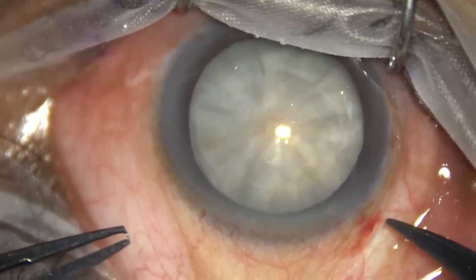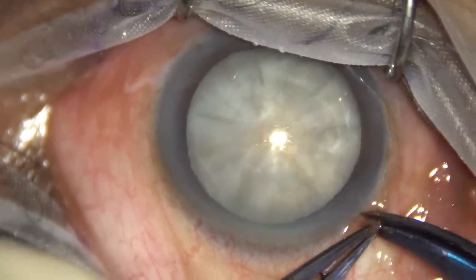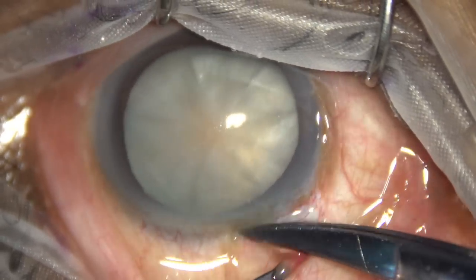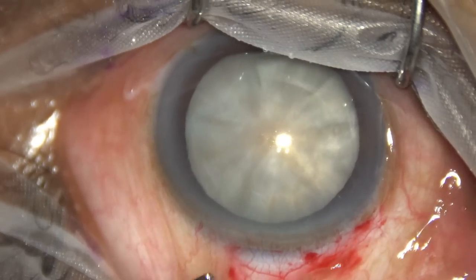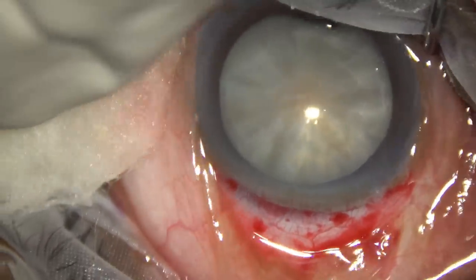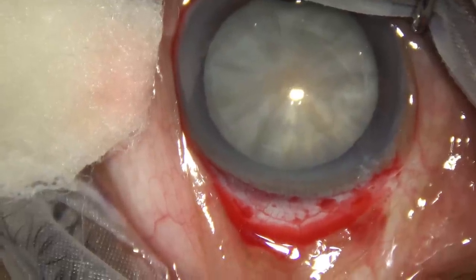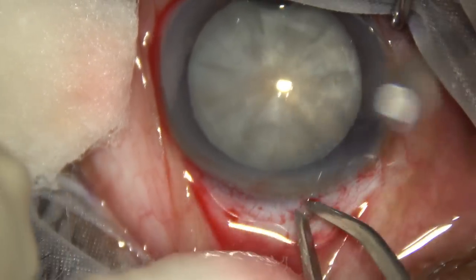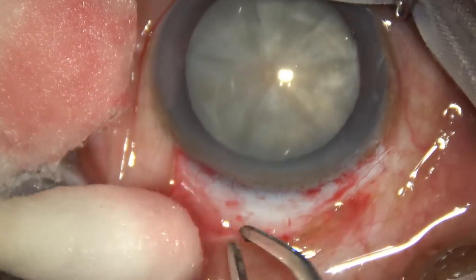And now peritomy of conjunctiva from 11 o'clock to 2 o'clock. The Tenon's and conjunctiva are being taken together, and this is the peritomy. Now this is Wet-field cautery. Very mild cautery is being done. Just touch over the blood vessels and come out.